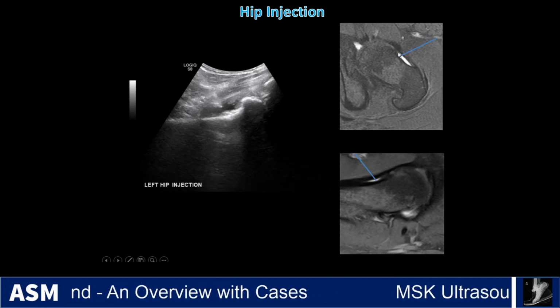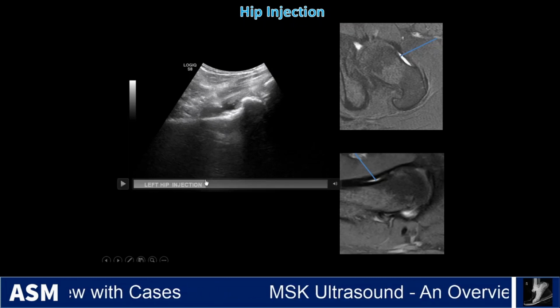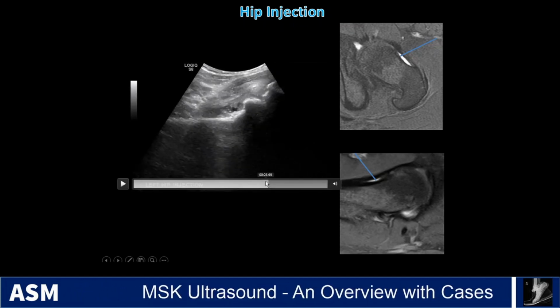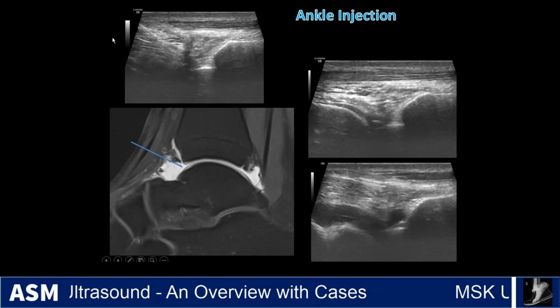and the reason being because you have this dip in the bone here, and you have this relative increased space between the bone and the capsule. And then, like I said, when you inject steroids into fluid, sometimes you'll see the echogenic steroids floating around inside of the joint there. So this is an ultrasound-guided hip injection.